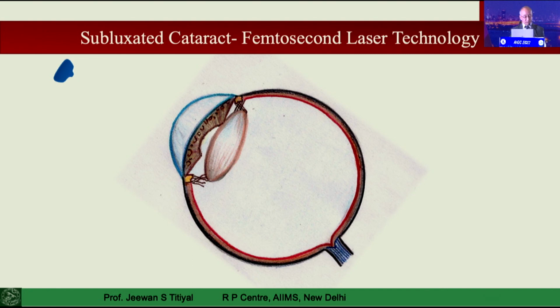This is the second option, which I consider one of the good indications for using a femtosecond laser in a case of subluxation.